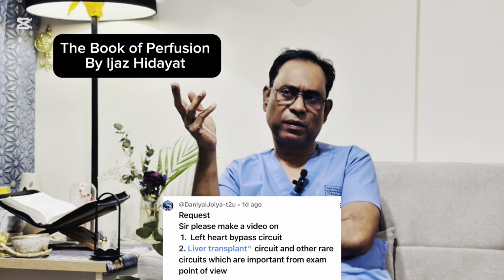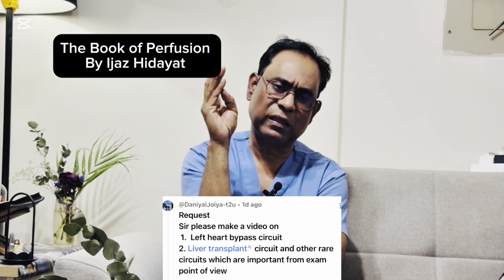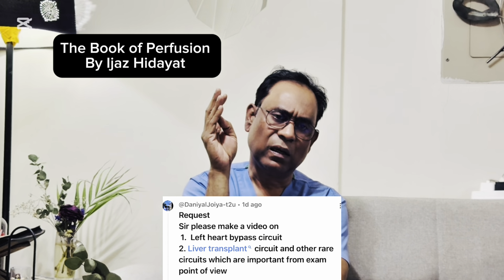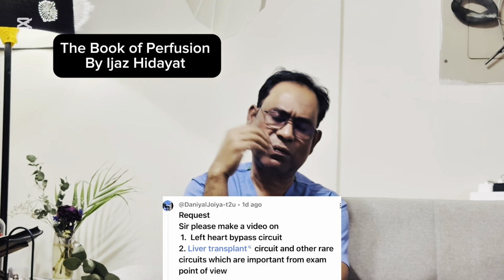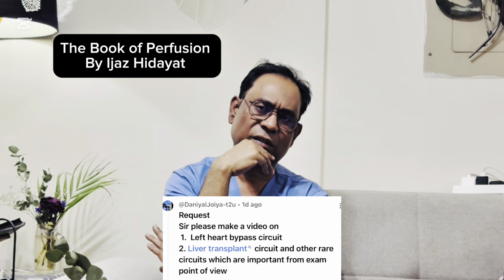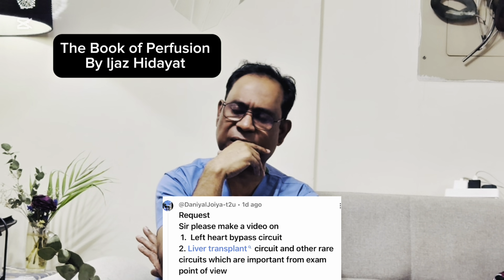So now we will move to the left heart bypass. The major factor is that you are maintaining a cardiac index of 2 to 2.4 liters, and we are not achieving full flow, just half flow, maintaining the pulsatility of the flow without using the oxygenator. Our target is to keep a perfusion pressure of 60 to 70 millimeters of mercury.